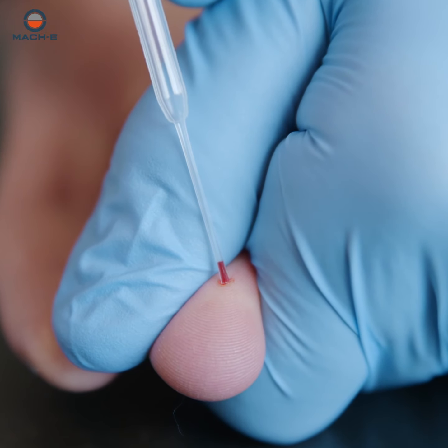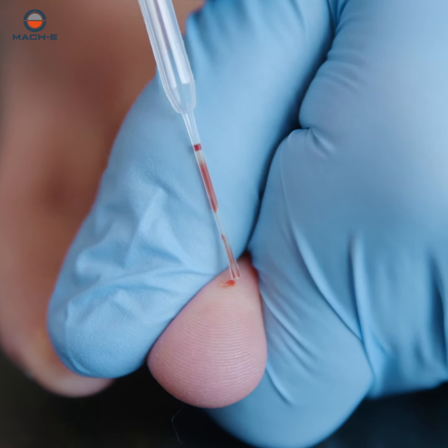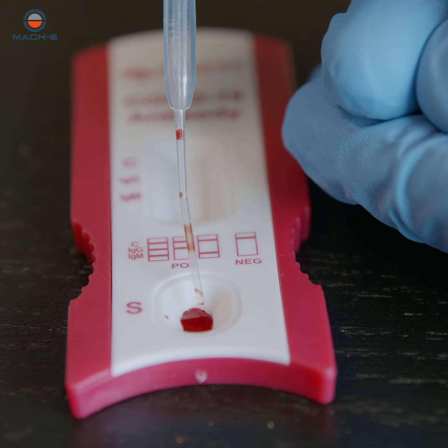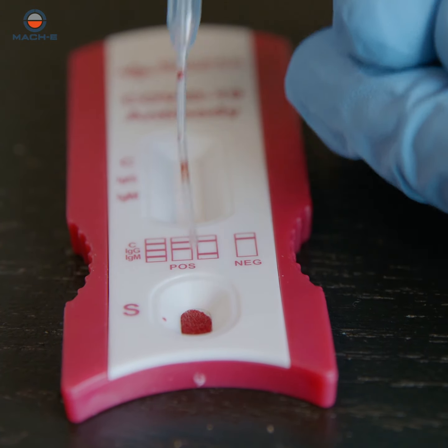Take the second drop of blood using the dropper included in the kit. Transfer the blood sample to the specimen window, positioning the dropper one centimeter above to transfer one complete drop of blood.